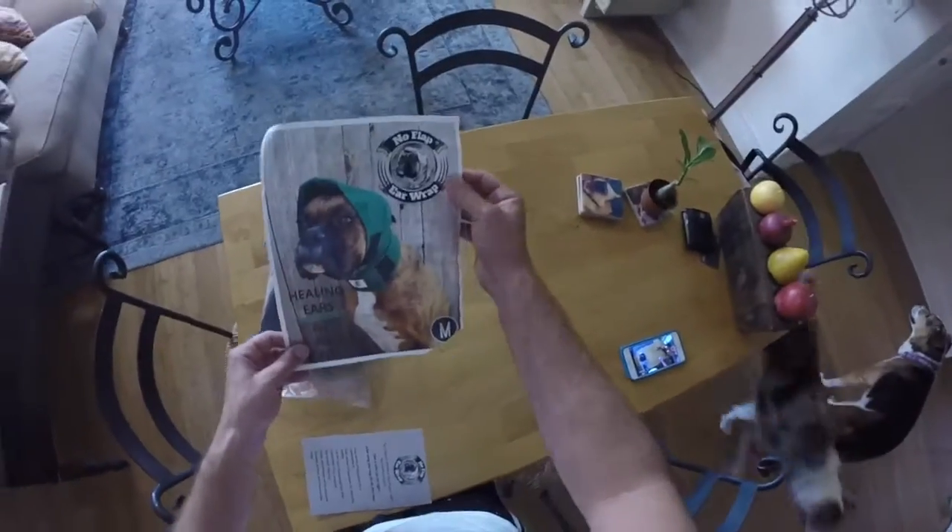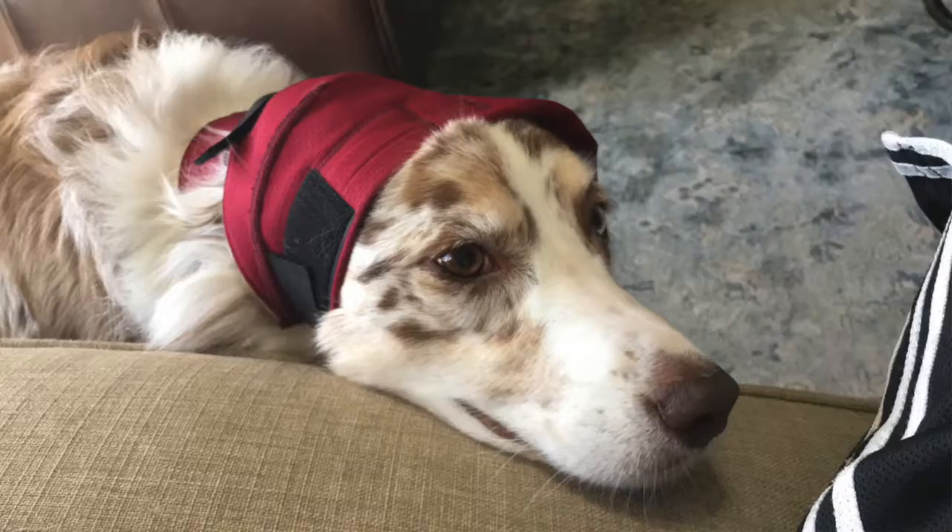Jeff Kaplan with dogfriendly.com. As many of you know, our company was co-founded by a veterinarian — that's Dr. D. She's in a lot of our blogs and videos, and she's been using this no-flap ear wrap for quite some time, a couple years now, after surgery or any kind of issue with an ear she's working on.